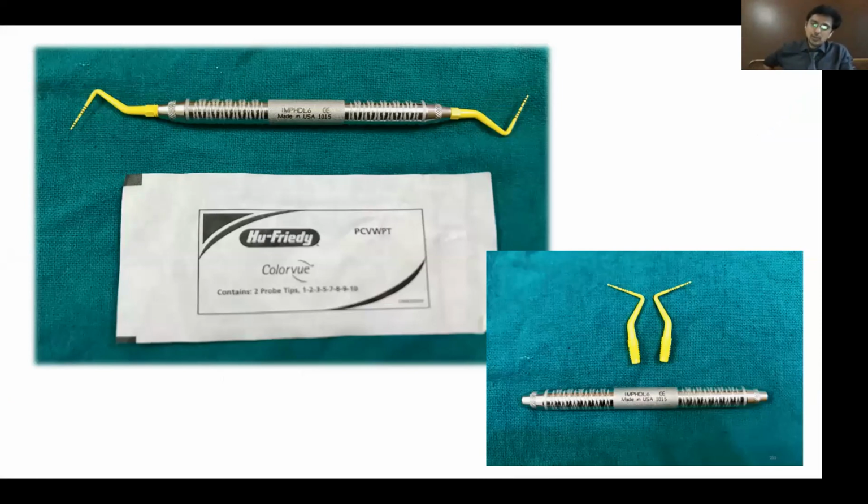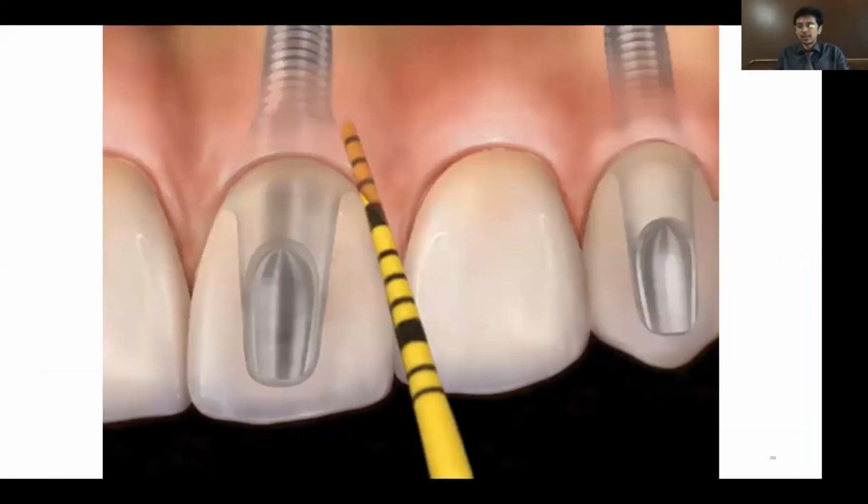Always and always use a plastic instrument. This is something which I bought many years back, around a decade back. This is an instrument which doesn't go anywhere. The handle is common. It can be used for another instrument, but always and always use a plastic instrument in relation to the surface of an implant, never a steel instrument. Stainless steel is much harder than titanium. It will abrade titanium. It will cause abrasion of the titanium, scratches, etc. Never ever use a metal instrument. Always use a plastic probe. It is easy to buy.